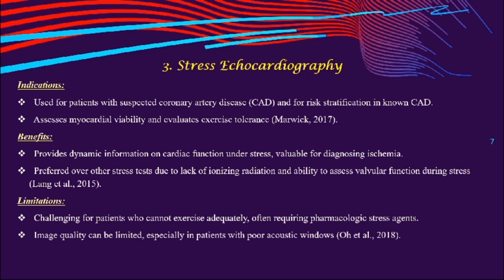Limitations. Challenging for patients who cannot exercise adequately, often requiring pharmacologic stress agents. Image quality can be limited, especially in patients with poor acoustic windows.